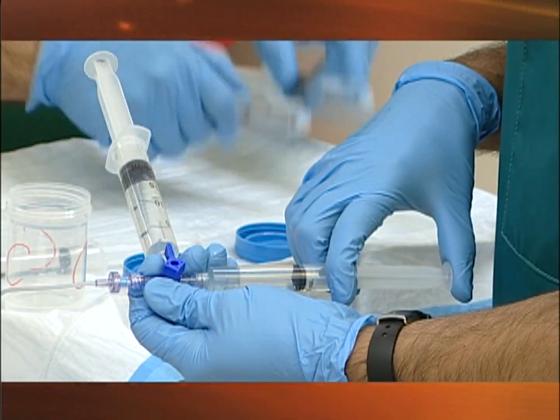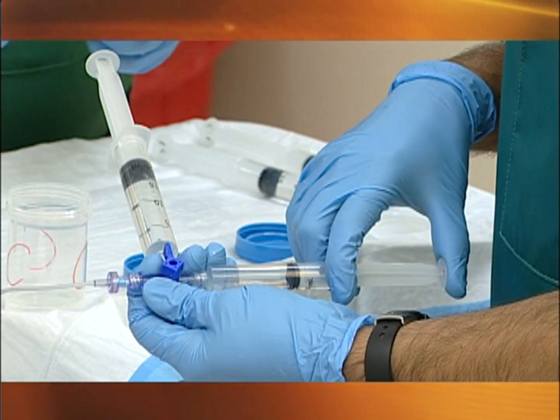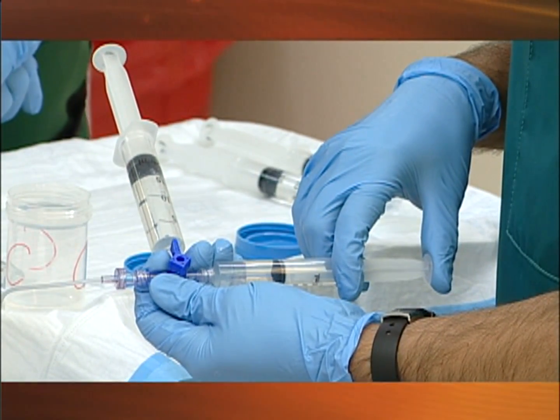For those patients who are already receiving dialysis through a catheter, the contrast injection is not of concern. However, those patients who are not yet on dialysis may have some concerns about receiving contrast dye. You may have been told by your kidney doctor to avoid contrast. However, in this particular case, it should not be a major concern. The amount of contrast which is used in our procedure is a small and insignificant amount, usually between 15 to 20 milliliters. In fact, doctors have actually measured patients' kidney function after the venogram and found that their kidney function did not worsen.